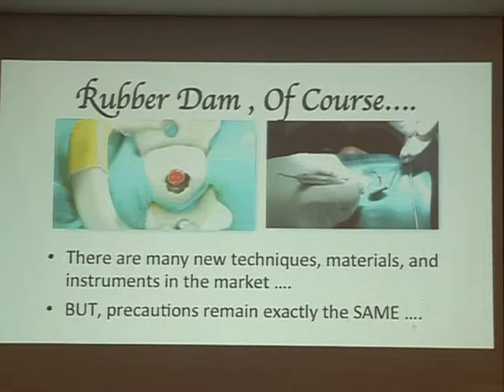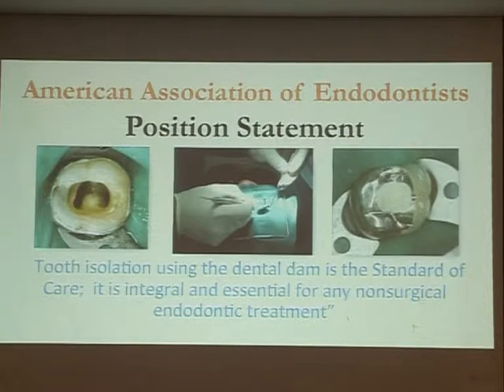There are many techniques in endo, but the precautions are what I am saying. Rubber dam has been used in dentistry for 150 years, more than 150. If something survives for that long, it must have merit. So that's my advice.